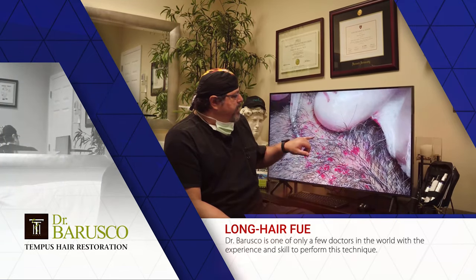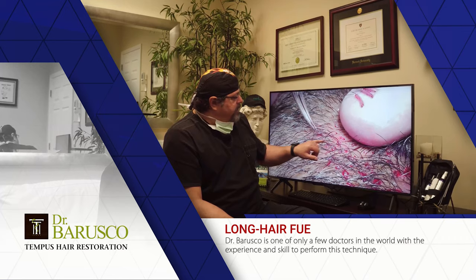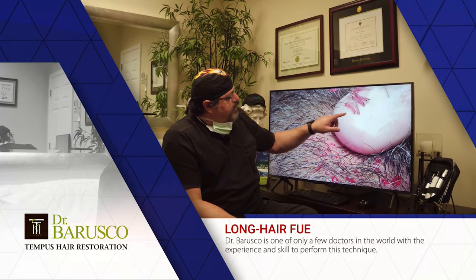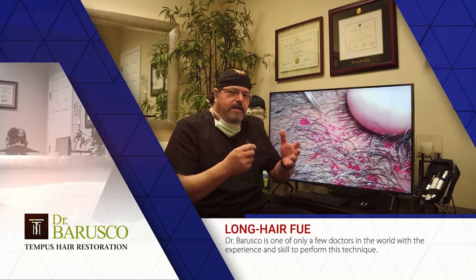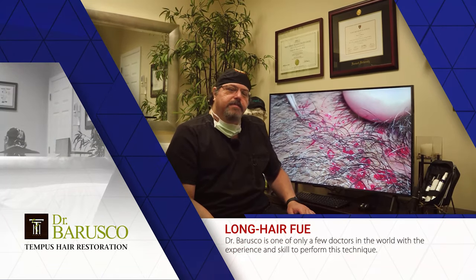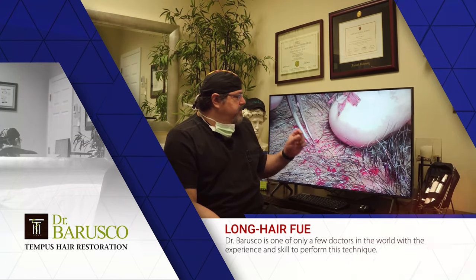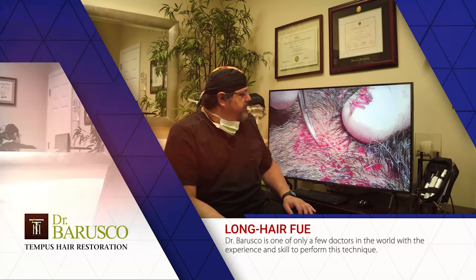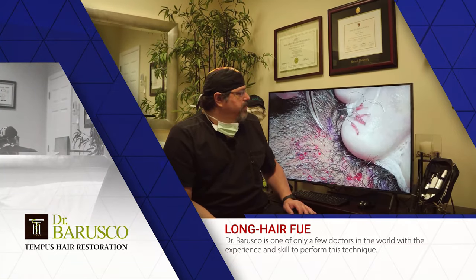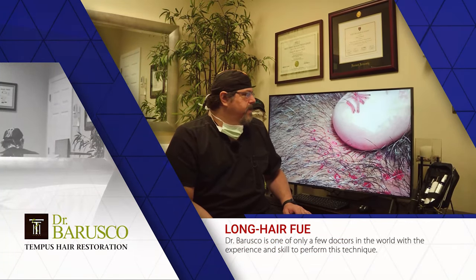With this technique — no shaving, no clipping — you punch and then pull the grafts from the side. You can see beautiful two- and three-hair grafts with the hair attached to them. It does get a little messy because you have hairs everywhere, so there's a specific method we use to keep them organized. But you use the same punch size as standard FUE — normally a 0.8 or 0.9 millimeter diameter punch — and you're able to get beautiful two- and three-hair follicular units with hairs fully attached. The incisions will eventually disappear.